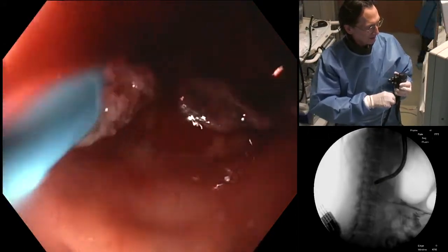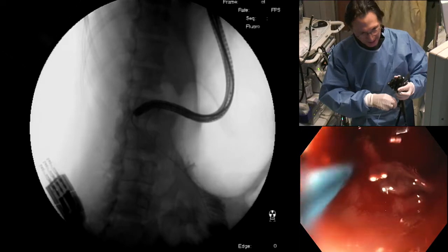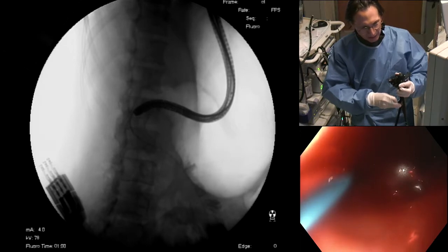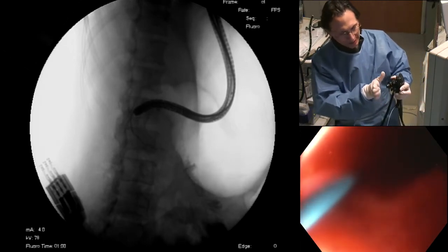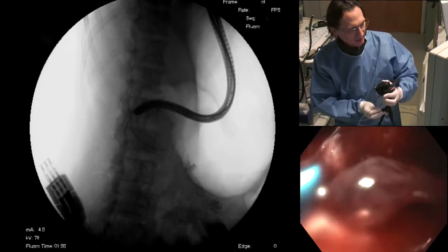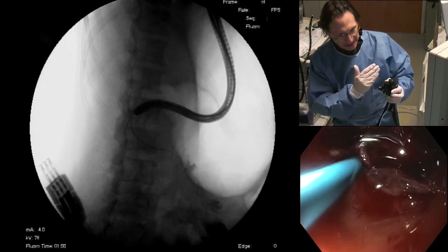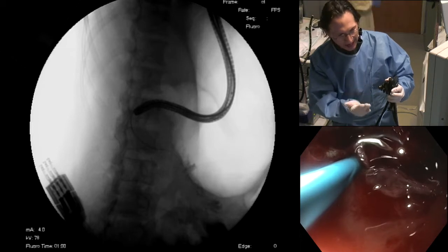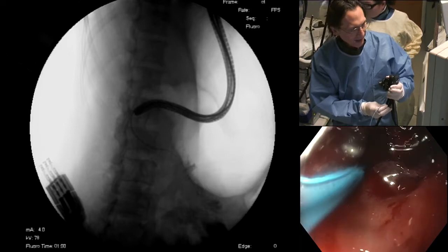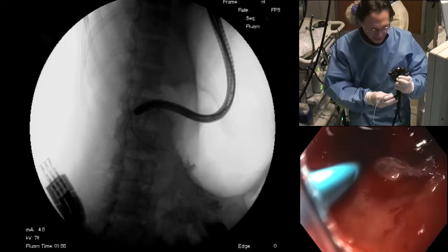There it is. Okay. And now we'll step on the fluoro to make sure that we are following. You can see right now everything's straightened out very nicely. You can see the outline of the stomach, very nicely because we filled the stomach with air. You can see where we're going to create our GJ. I think you can appreciate that very nicely: that part of the distal duodenum that is in apposition, literally in apposition with the greater curvature of the antrum body transition. All right, so I think we're far enough in.